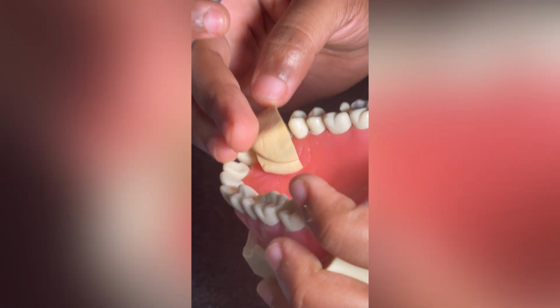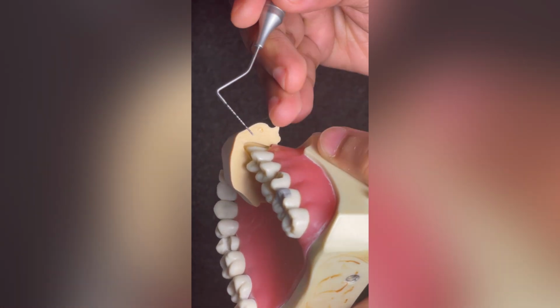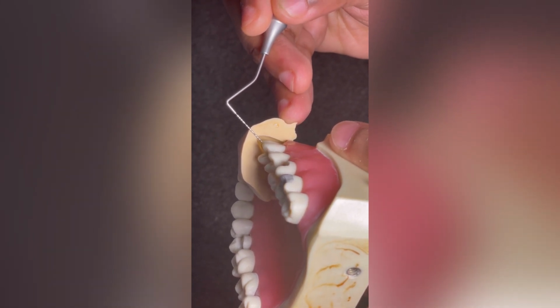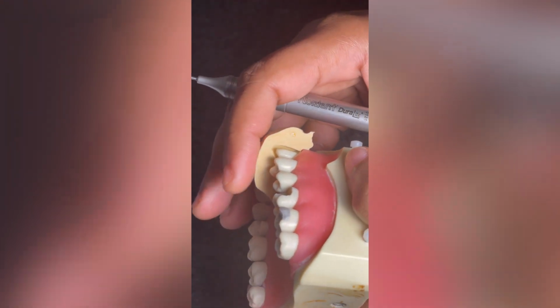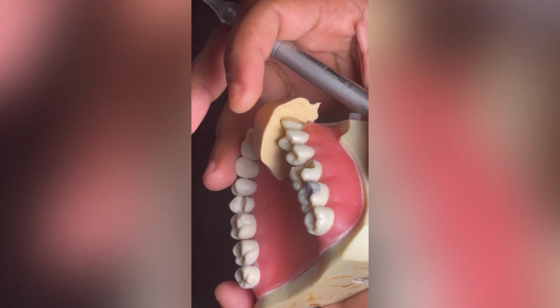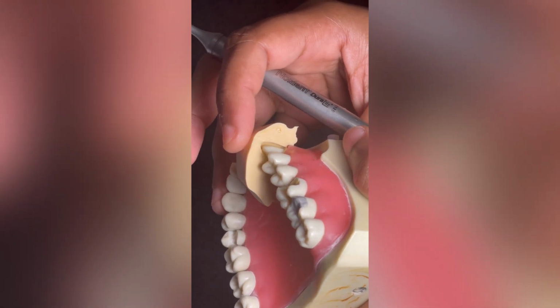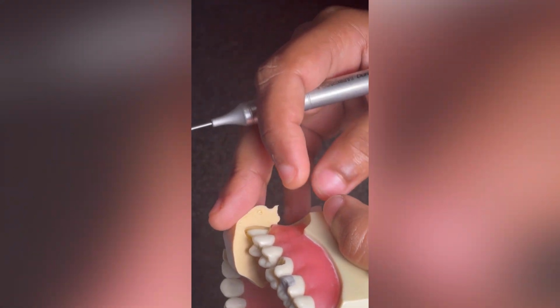First, make sure that the putty is nicely adapted to the margin. If you can see, it's actually 3 millimeters, or just 2.8 I would say. With occlusal reduction, over reduction is still fine, but do not under reduce. Very good says occlusal reduction of 2 millimeters, and you will fall in satisfactory even if you prep more than 2, until 3 is fine.